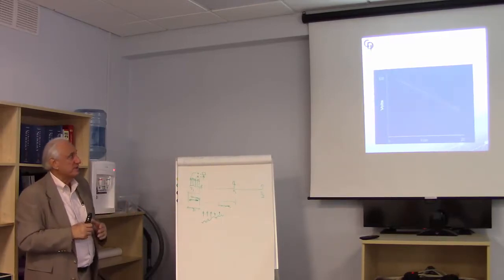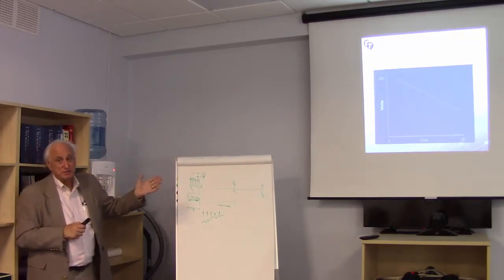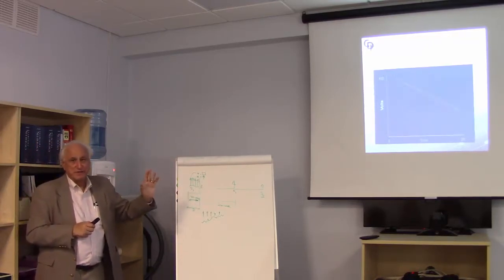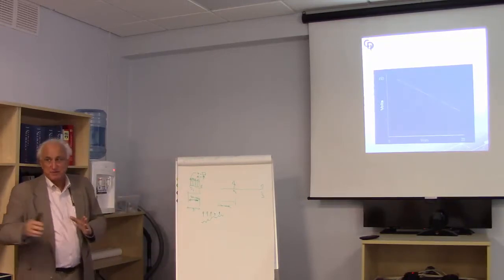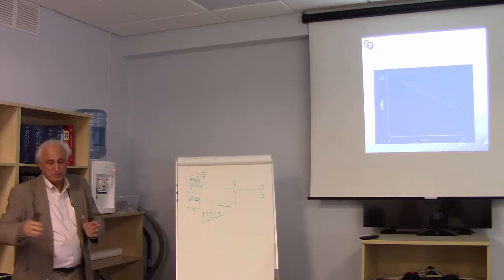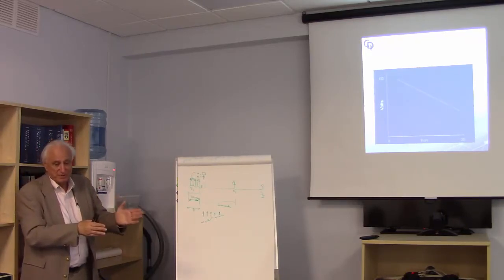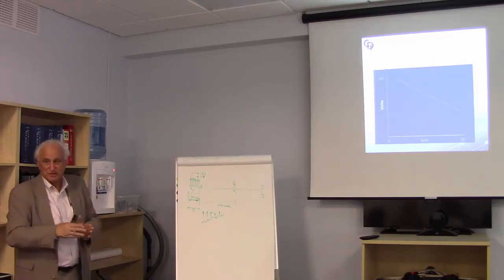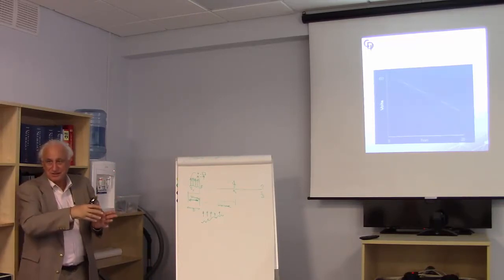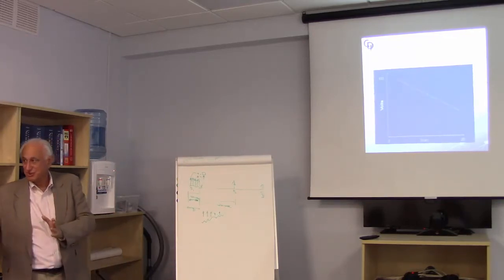And there's actually a similar effect, which I didn't mention in the SEPs, that people have studied. We've published some data over the years that show people tracked from about a month of age out to 10 years of age. And you can see the stimulus parameters changing, and you can see the architecture of the response changing as they mature.